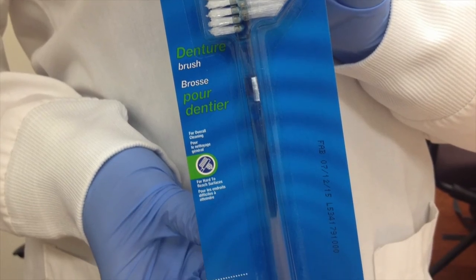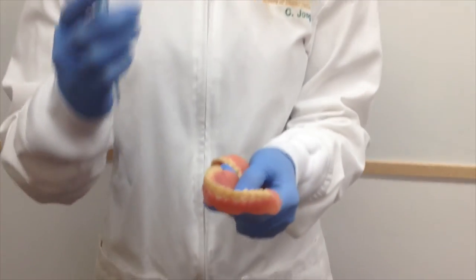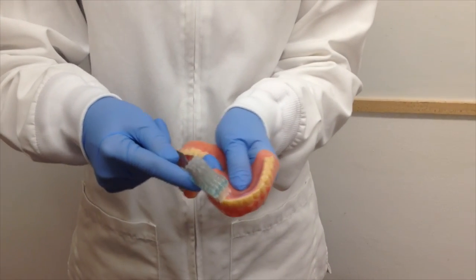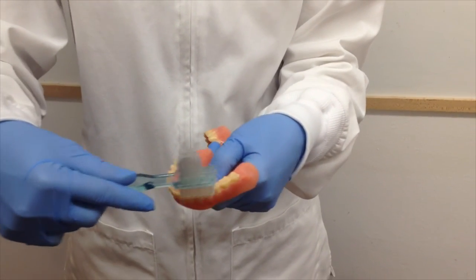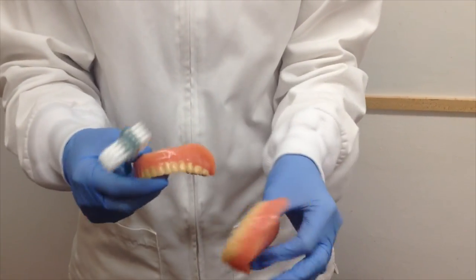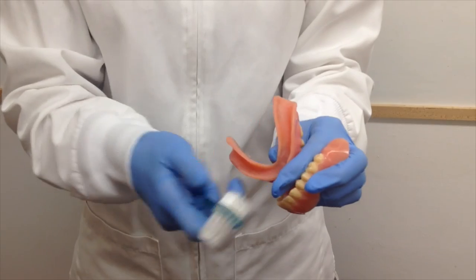Denture brushes. These two-sided brushes work effectively to clean complete or partial dentures. Mild dish detergent can be used to clean dentures while rubbing off plaque buildup. Remember to be careful not to squeeze the denture too hard and to clean over a towel-lined sink full of water to avoid any damage from squeezing too hard or dropping the dentures.